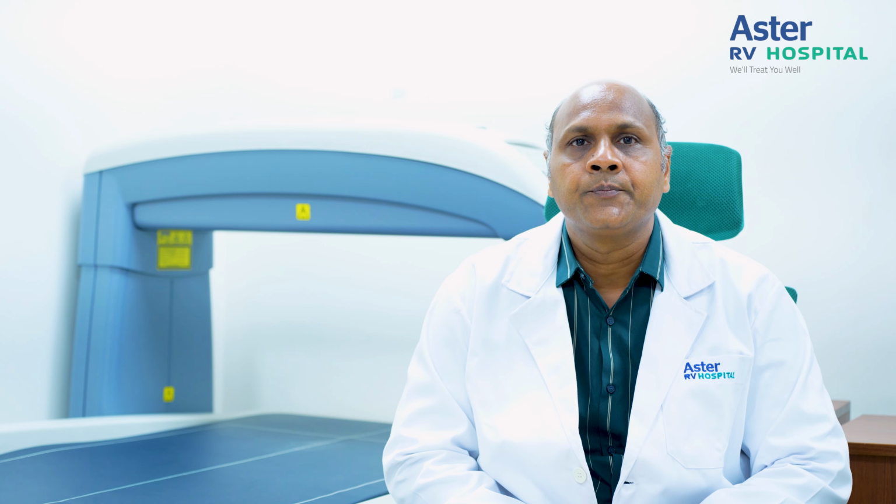If we are doing CT angiography of the brain, then we can understand about the carotid arteries and the circle of Willis or the arteries of the brain. If we are doing CT angiography of the lower limb, we can understand about the arteries of the lower limb like femoral arteries, popliteal artery, and the below knee tibial arteries.